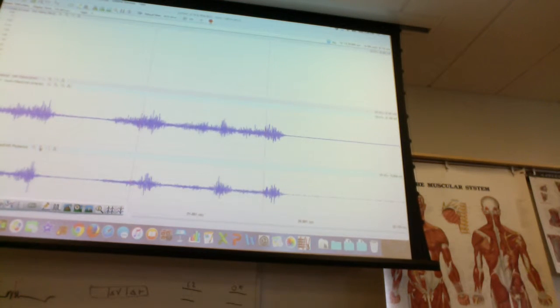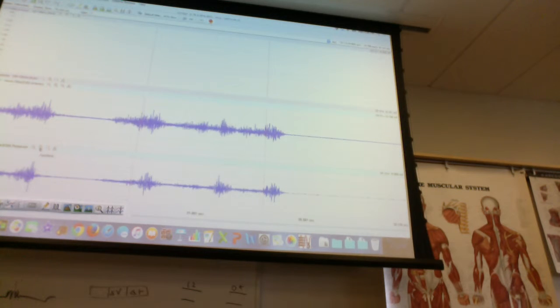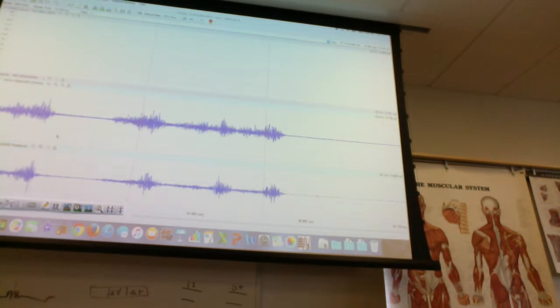So how do you slow it down again? You deal with little mountains. I always get them mixed up, but I think the two mountains is slowing down, the one mountain is speeding up. That's speeding up. Two mountains. You get to run away to stop it, and we'll go to the next step in a second.